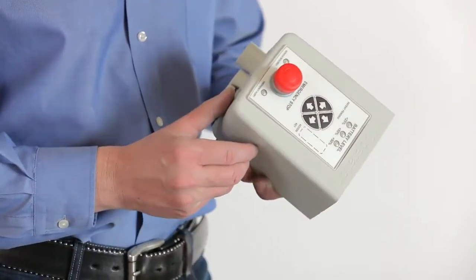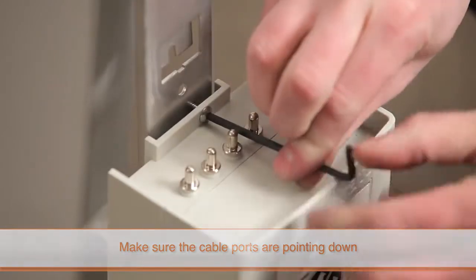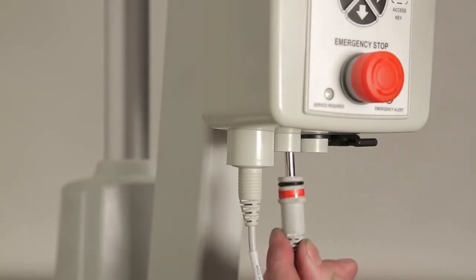To install the new control box, place it on the mounting plate with the cable ports pointing down. Then slide the box down so that it is secured by the tabs at the end of the mounting plate. Replace the Torx screw on the top of the control box and securely connect all of the cables.